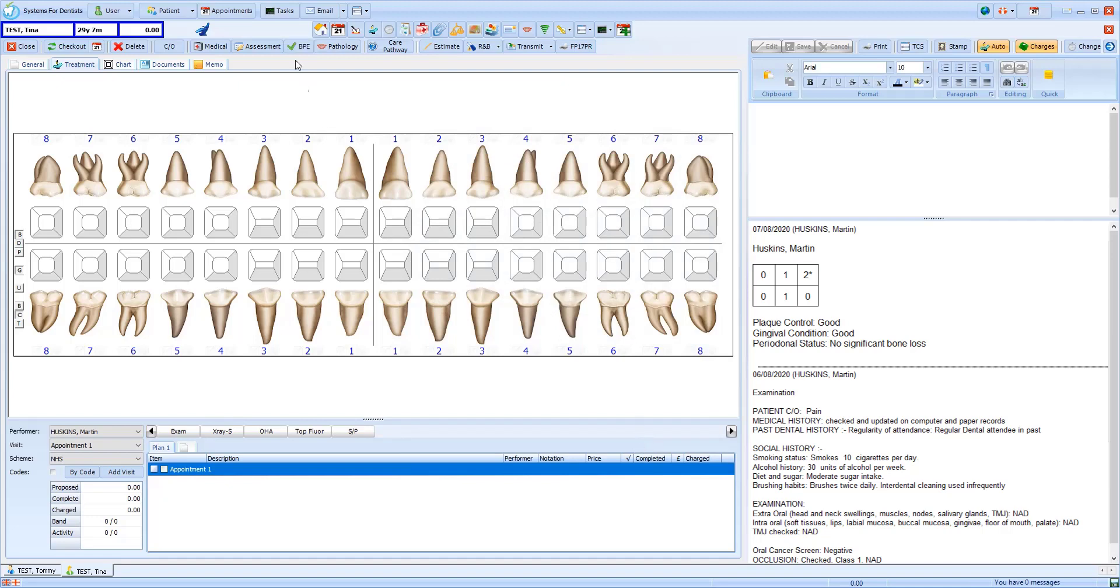On completion you will see that a green tick indicates that the BPE has been recorded. The information and values that were recorded are displayed in the patient's notes.